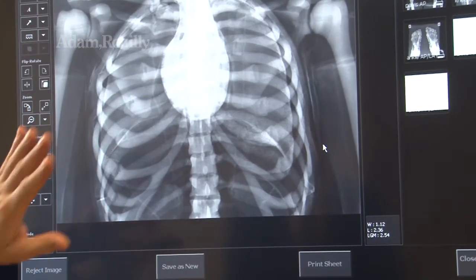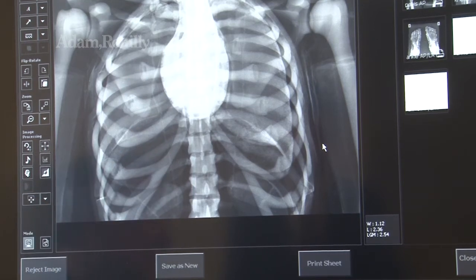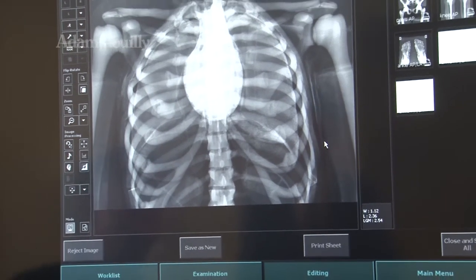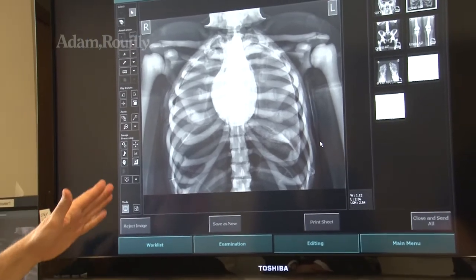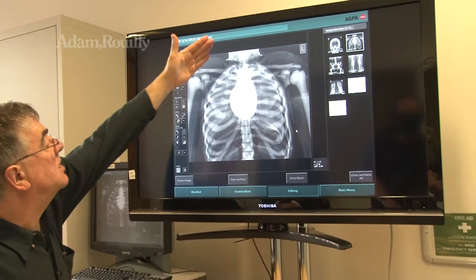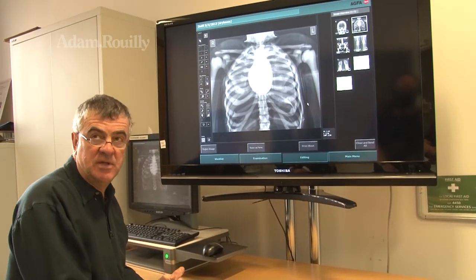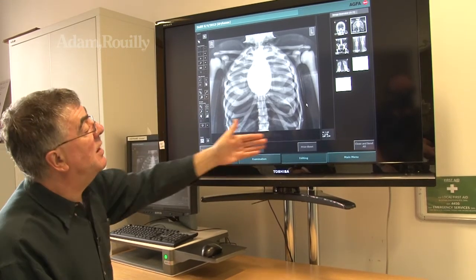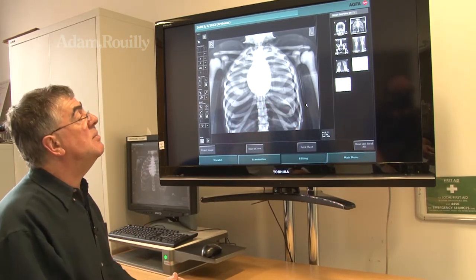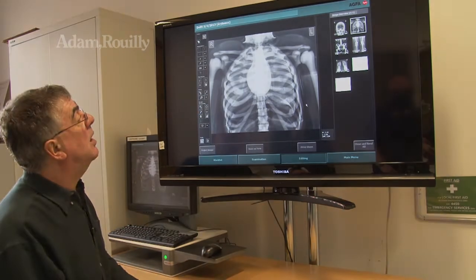But it shows the true density that you'd expect, because the heart is very muscular and would show up as dense as bone on a chest X-ray, because not much radiation has passed through it. Again, we have the shoulder joints, the clavicles, there's the bottom of the neck. So we've shown all of the axial skeleton, which is the real major purpose of this exercise. We're not worried about the limbs here. I've examined them physically, and we've done the whole part.